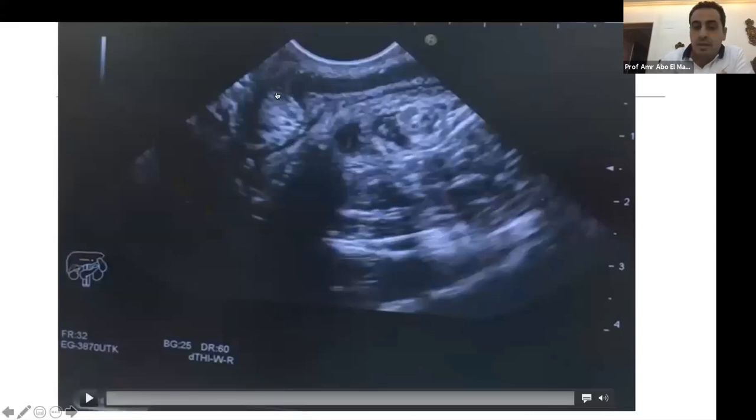Back to the last part of the examination, the anal canal. The prostate is anatomically just near the anorectal junction. If I can find this, I can find an important landmark, which is the waterfall sign, or downward continuation of the fourth layer, the muscular layer, giving a picture of the rectal ampulla.